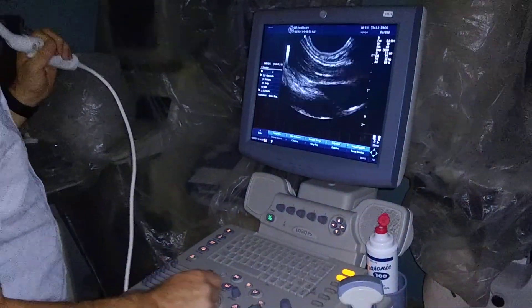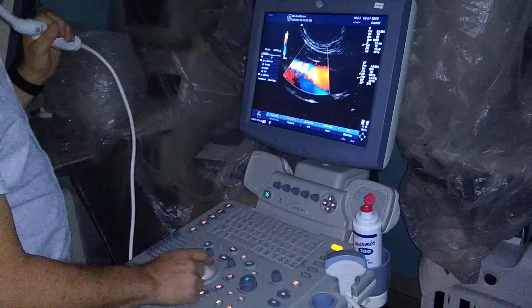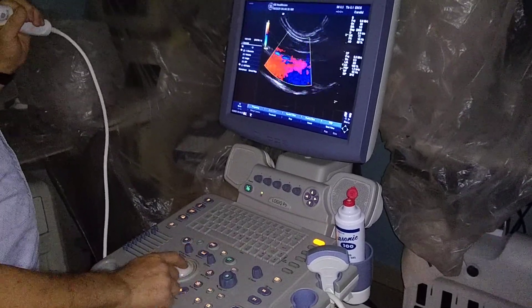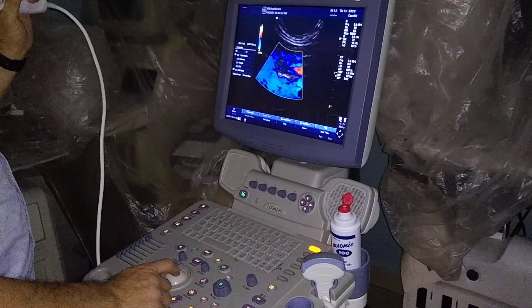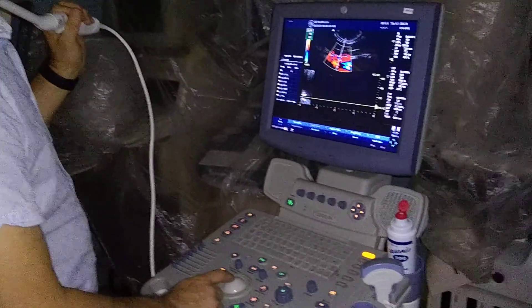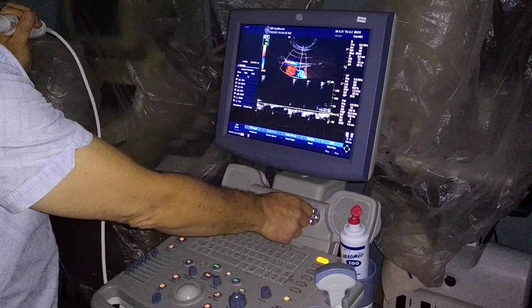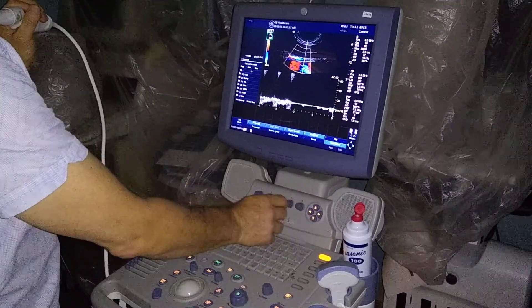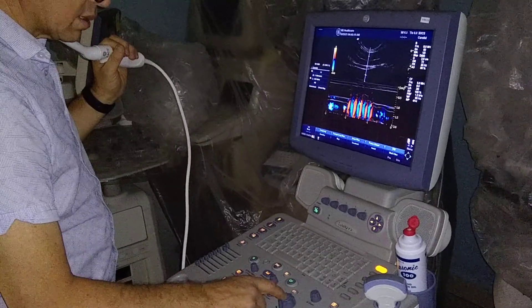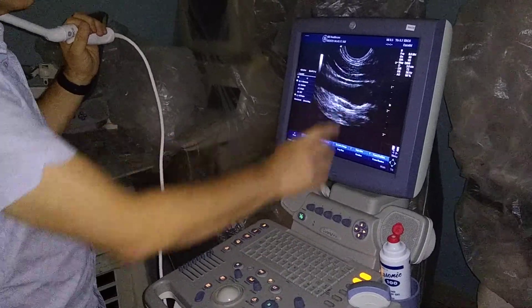I am going to set this for vascular — turn the light off. I am testing that in my carotid. Now the PWR — I am testing that in my carotid. Let me go a little higher. As you can see, the image is very good, top.